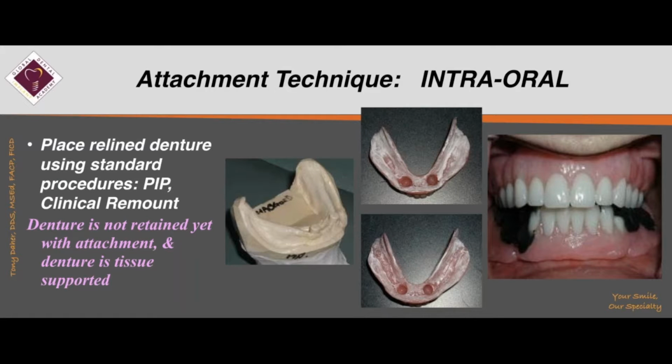Now, let me show you these slides here. I got that denture from the lab. I made the holes a little bit bigger so the implant or the healing abutment here do not touch. And then I did a pressure-indicating paste (PIP) on the denture. And you see on the slide on the top, a very tiny area is touching the soft tissue. But I did the PIP.